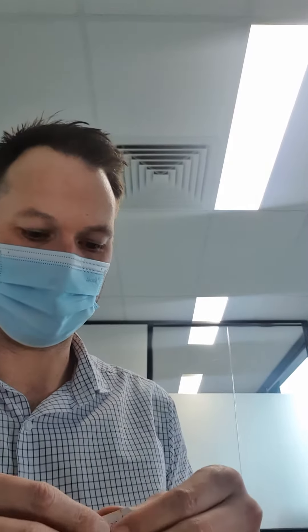Hi, Sam here from Pinage Layhand Therapy. I'm just going to show you some basal thumb taping. We're going to use a piece of tape that's about 8cm long and about 2cm wide. It's a combination of two other videos that we did earlier where we did the taping through the web space and under the base of thumb, with a little bit of variance on this one.